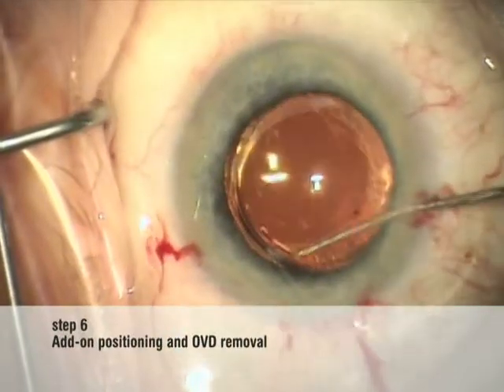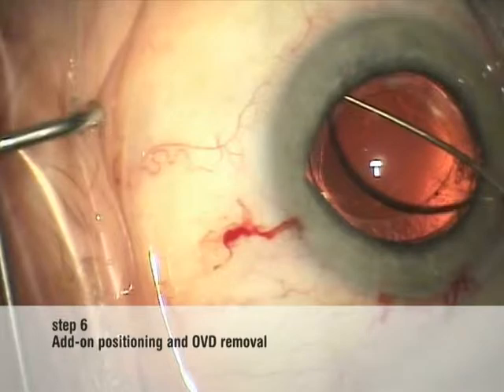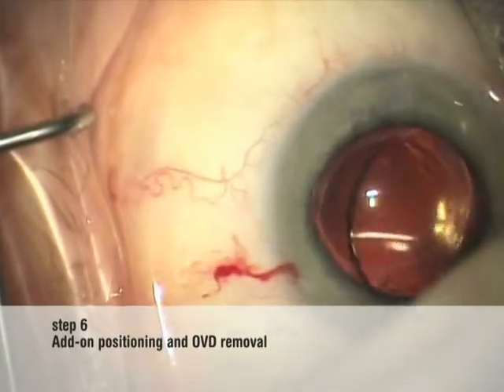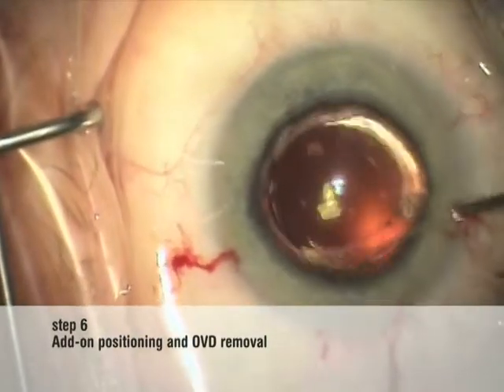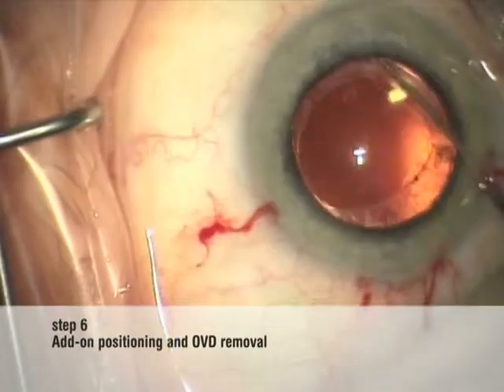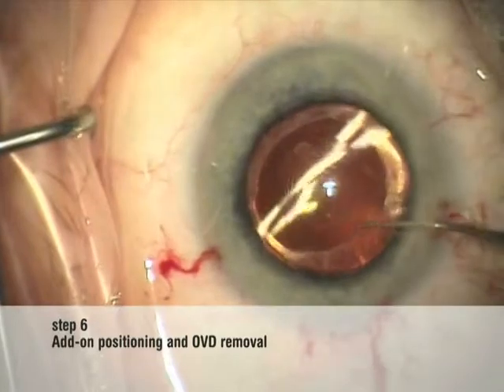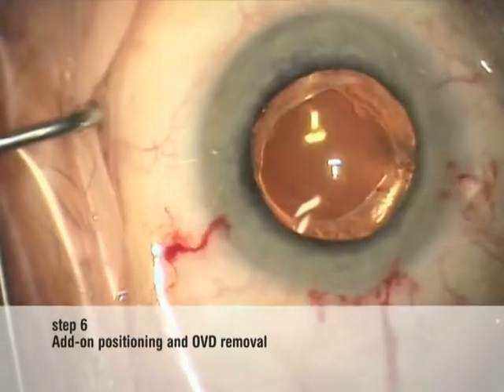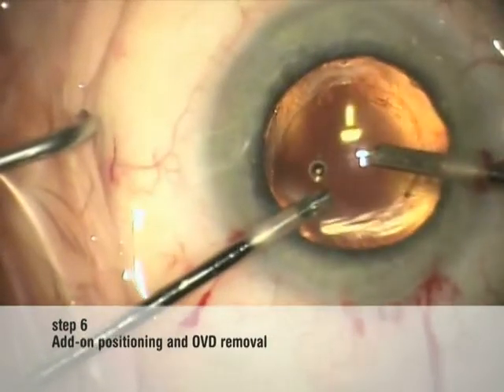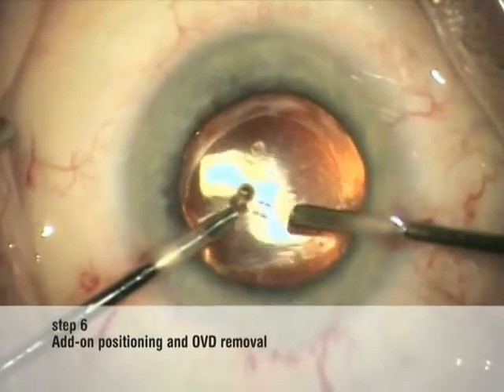The OVD has to be removed to avoid a post-operative pressure rise. We use a bimanual approach to access the OVD between the IOLs more easily. The add-on centration is usually immediately perfect and permanently stable, not influenced by changes of the capsular bag. The add-on optic is curved on the posterior surface so that it does not touch the capsular bag IOL optic anywhere — this safety gap between the optics is constant over time, as published in the JCRS 2010.